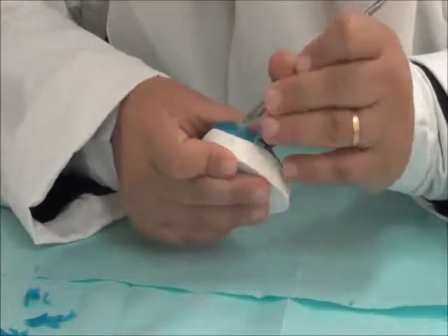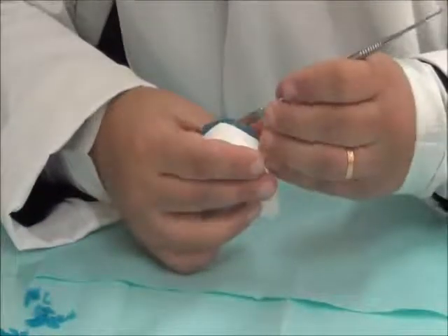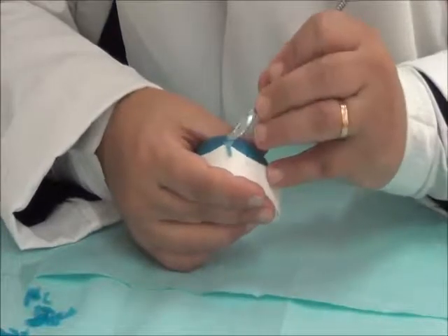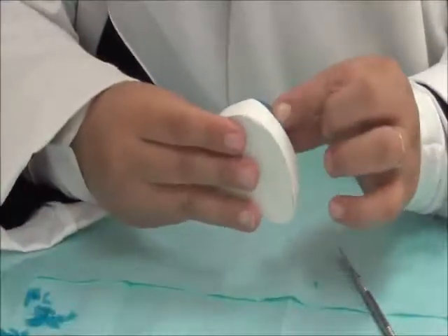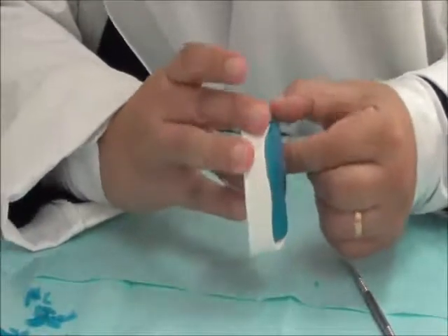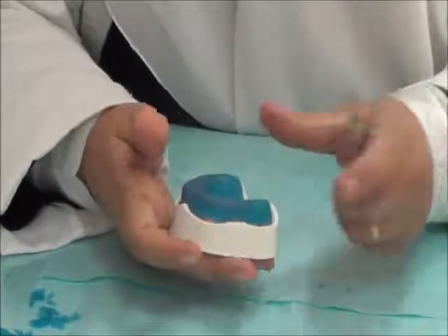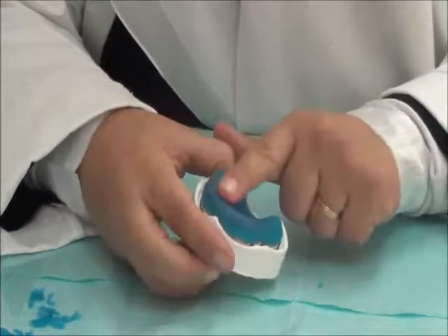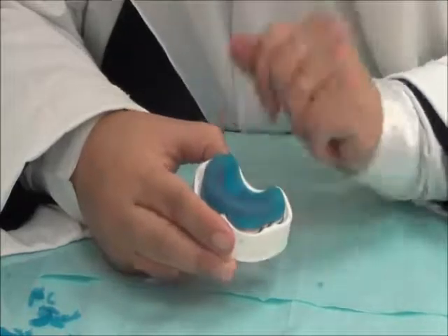So this is our tray material added. Light cured acrylic, once I put it inside the light, it will initiate the polymerization reaction, and this polymerization reaction might cause it to shrink a bit, and this shrinkage of the material might take the tray away from the tissue. So there are methods where we cure part of the material first, and we light seal this surface and then cure the surface alone.